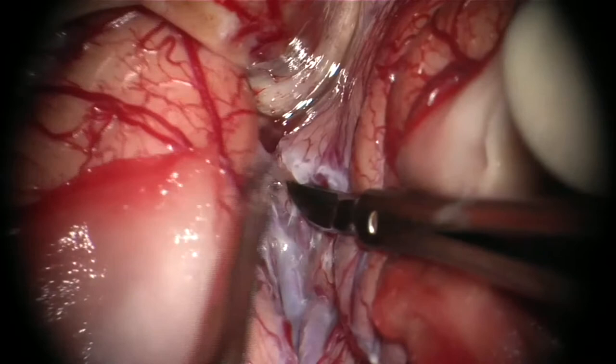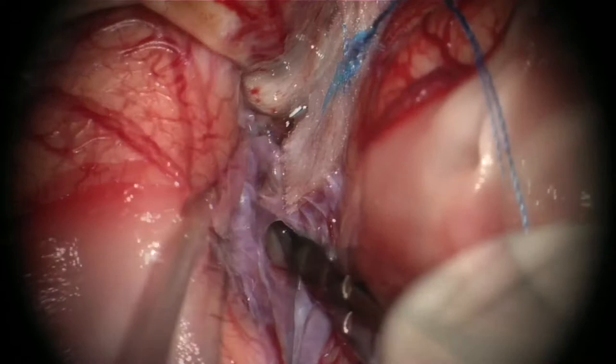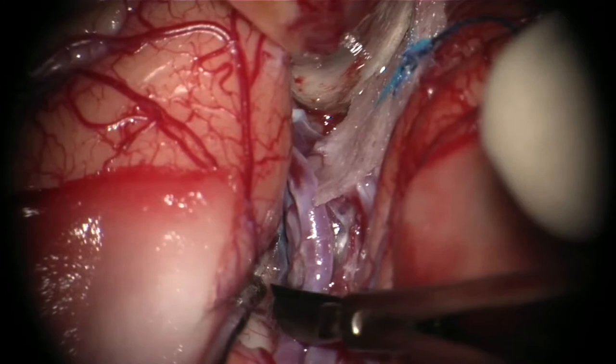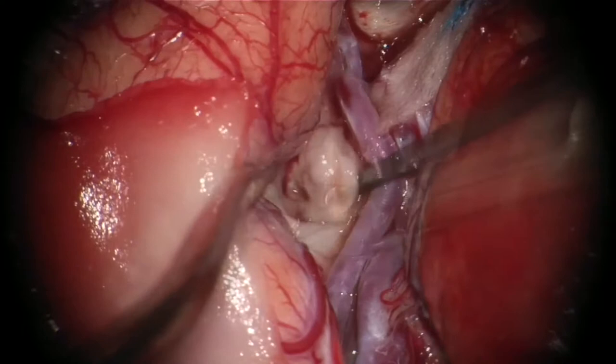There is usually a vein running in the inferior insular sulcus. And now we're starting to see these early temporal branches that come from the inferior trunk of the MCA. These temporal branches need to be mobilized so I can access the upper surface of the uncus and the planum polare. You can see the insular vein. And I start coagulating the veins on the surface of the planum polare to access the tumor from its upper surface.